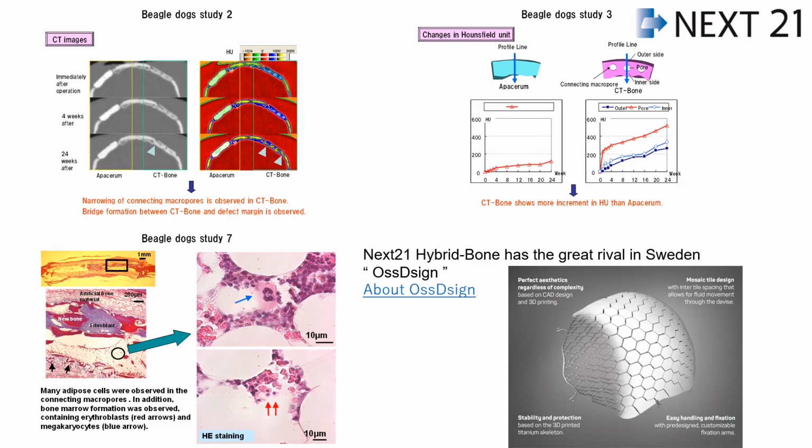Using a dog, we observed bone marrow invasion and integration with the mother bone when a communicating hole was made in the CT bone as an internal structure. HA hydroxyapatite bone graft is inactive in bone regeneration and has no internal communication holes for bone marrow invasion. So no bone fusion or bone replacement has been observed over time. CT bone has the characteristics of both osteoconductivity and bone fusion. You can see a lot of intrusion. Bone invasion is also seen in the parenchyma. After 4 weeks, a morphology similar to normal bone with bone marrow inside was observed.